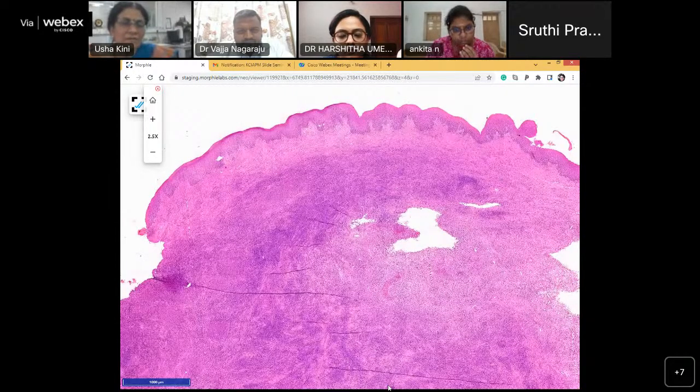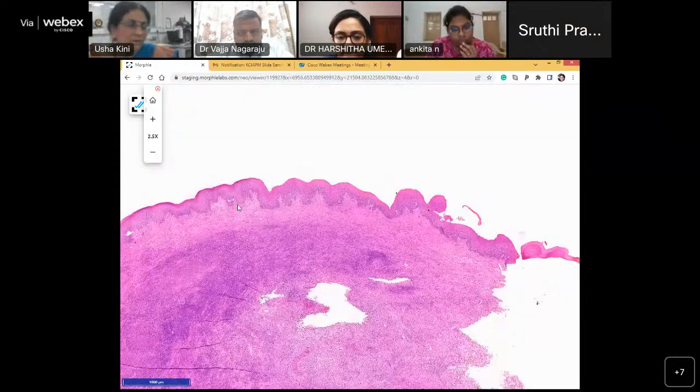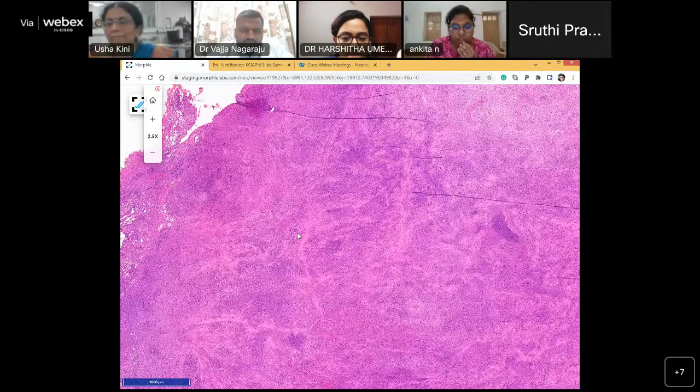You see the surface mucosa is unremarkable, right? It's not ulcerated. Patient seems okay, right? And then you see that there is a lot of blue because of the infiltrate. Now I'll take you to the higher magnification, which is what you were saying, right? These are blood vessels, right? Yes, ma'am.